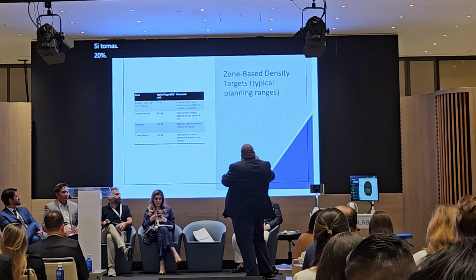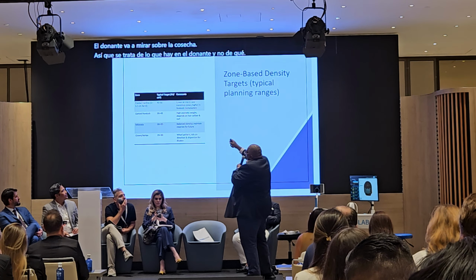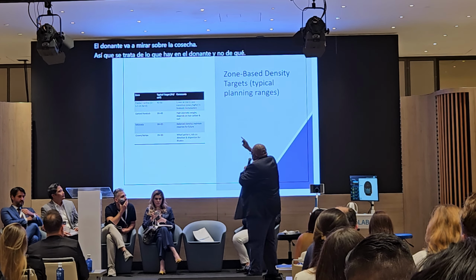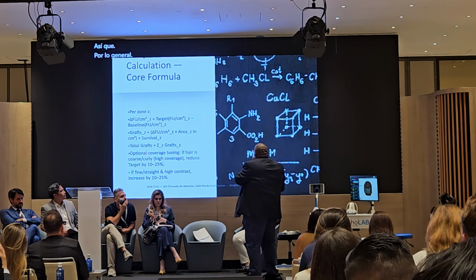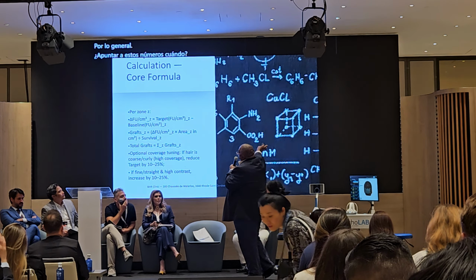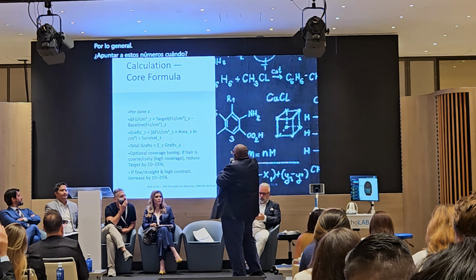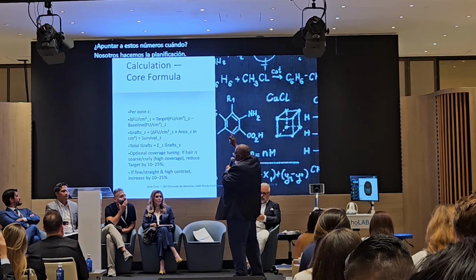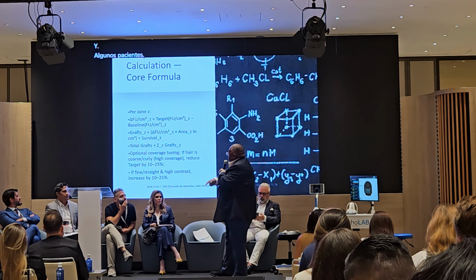So we usually shoot for these numbers when we do the planning, and some patients may require you to do a lot of calculations. So how do we calculate the number of follicular units that we're going to plant? The target follicular unit minus the baseline that he has. I like to do this calculation.